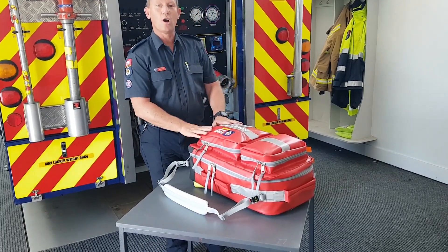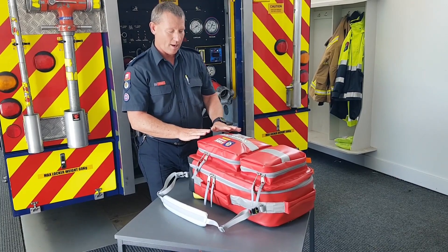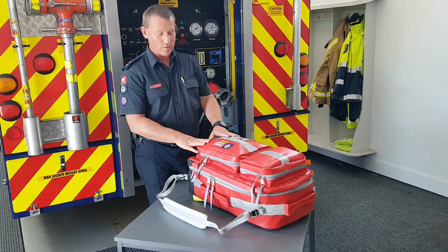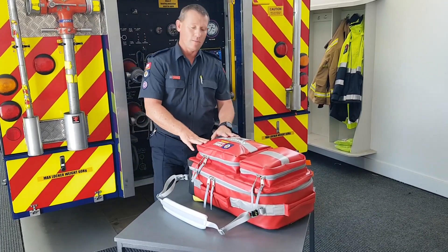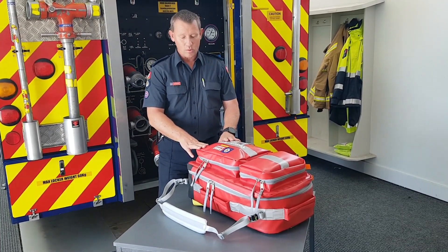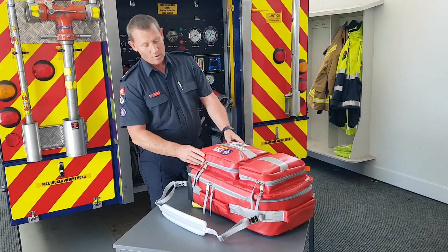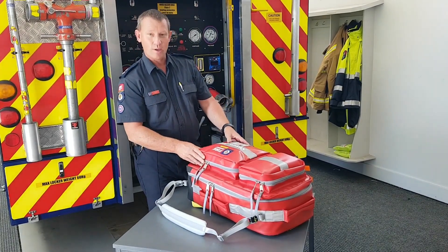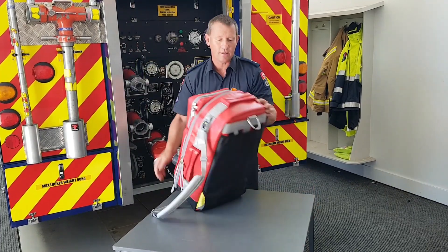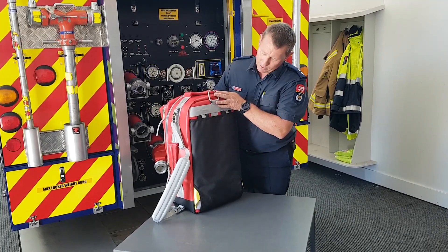We have spent a lot of time developing and investing in this — it's not a cheap product. It's made by an Australian company who make professional ambulance bags for all sorts of ambulance services, and the kit has been developed with input from ambulance, urban and rural firefighters, and first and co-responders as well. The material is impervious to water, so you're not going to have the issues from previous packs where you get a wet job and water gets into the pack. The material in the black here is very hard wearing and should save any damage from being dragged around.